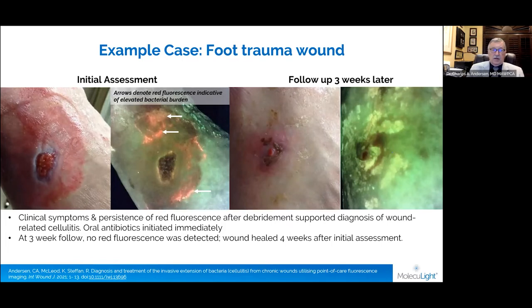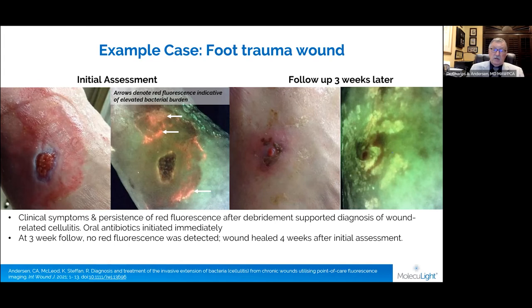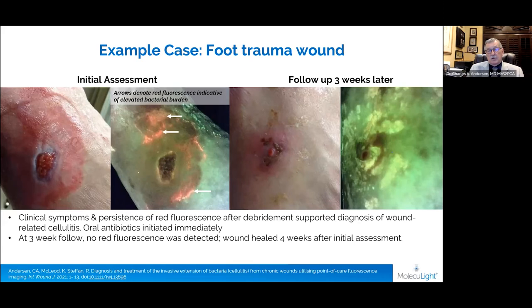This is another example. You can see the wound and the outline of a dressing that's been over the wound, with some erythema in the area of the dressing. Could it be a reaction to the dressing, or moisture? What the scan demonstrates is bacteria that could not be removed by thorough cleansing. So this is a patient we did go ahead and put on a short course of oral antibiotics, and that cleared up very rapidly. The patient then progressed with no further evidence of bacteria and healed the wound very promptly.